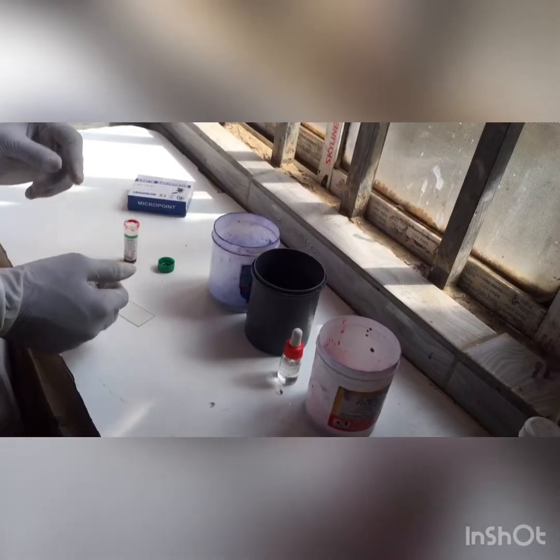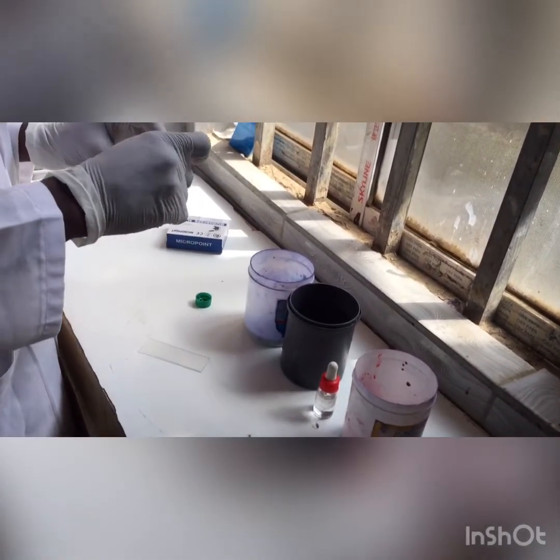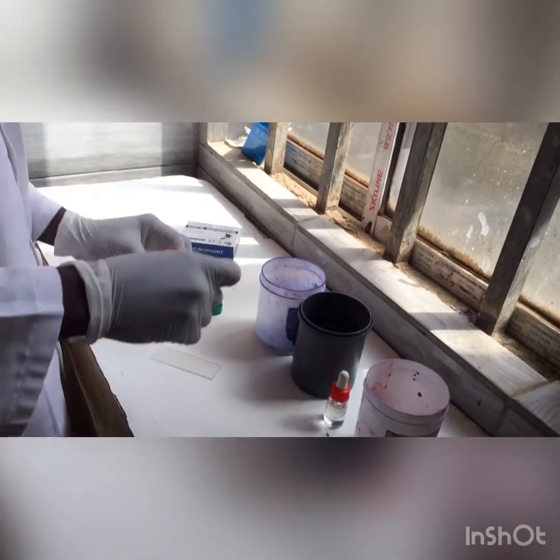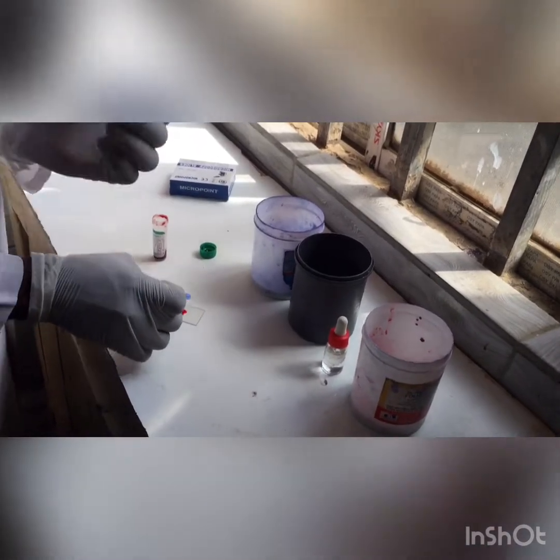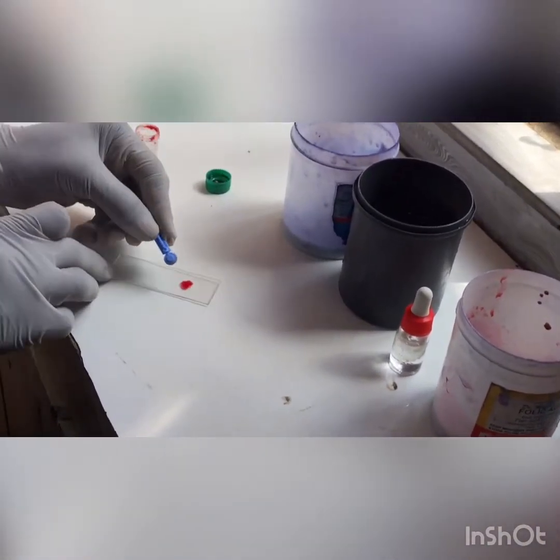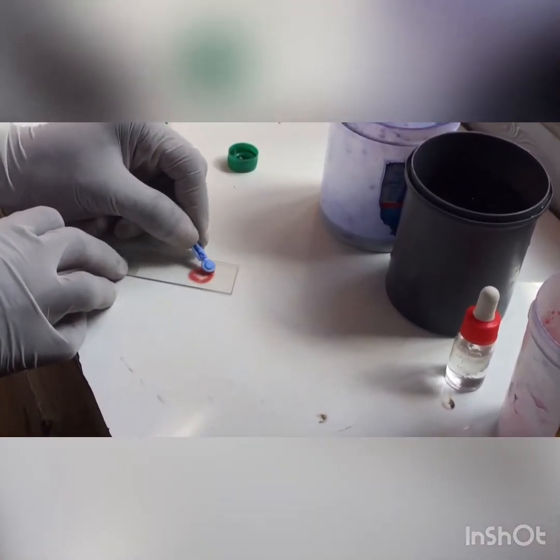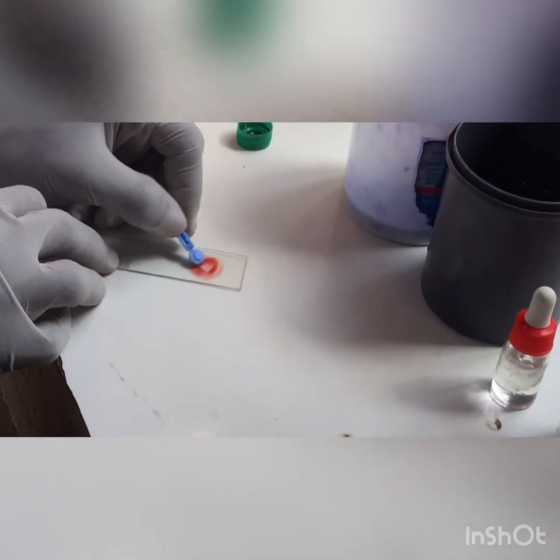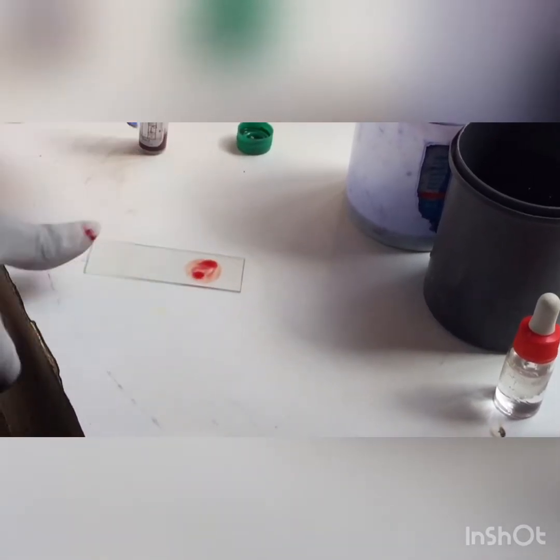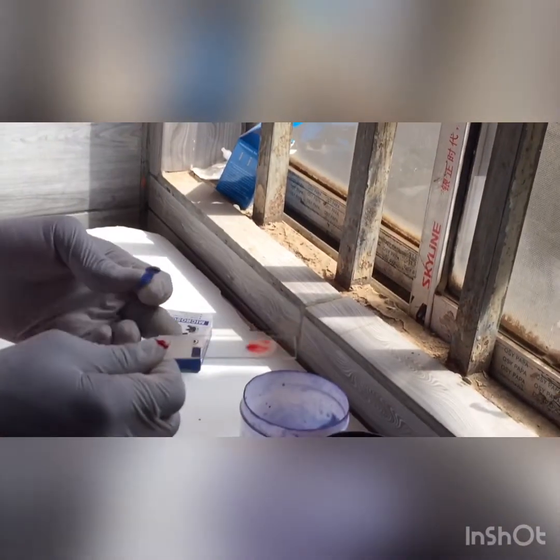I'm going to be making a thick blood smear. After that I will allow it to dry. I'm going to take little drops of my blood sample and place it on my glass slide, then go in a very circular motion to make my thick blood smear, making it very thick. After that I'm going to allow it to dry for about 10 minutes.